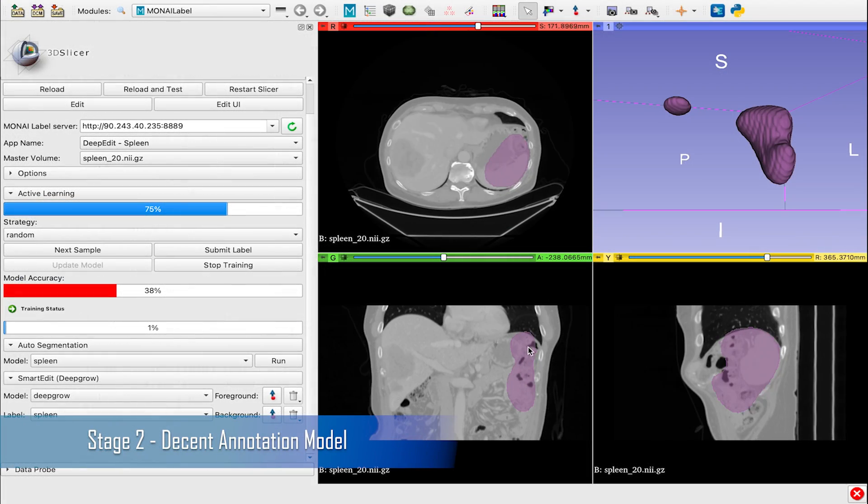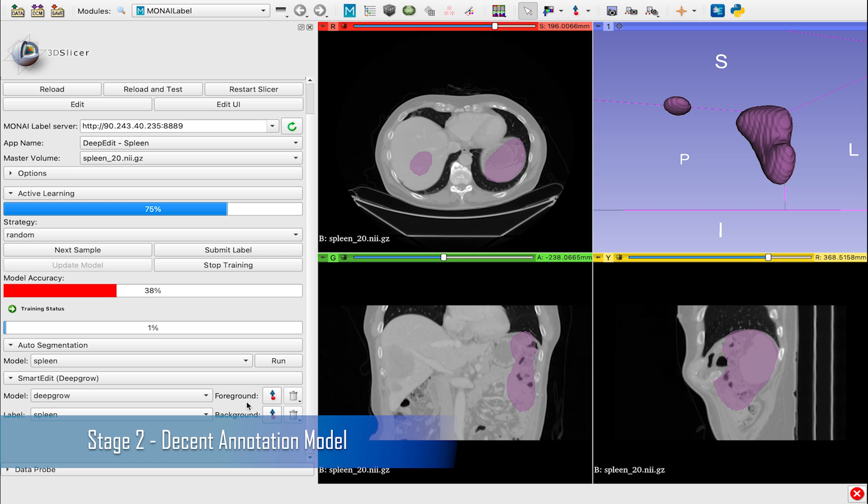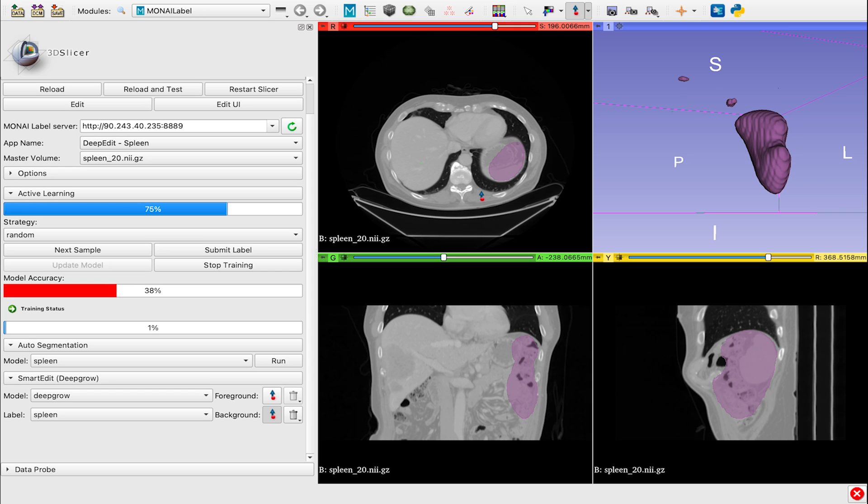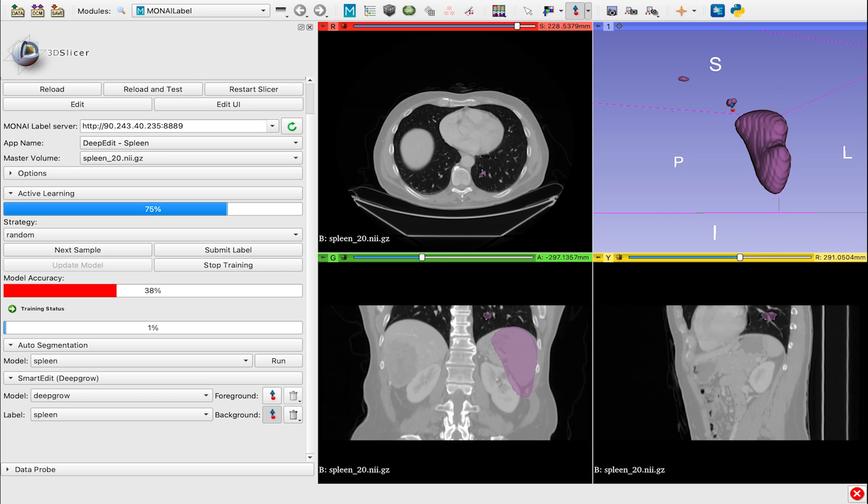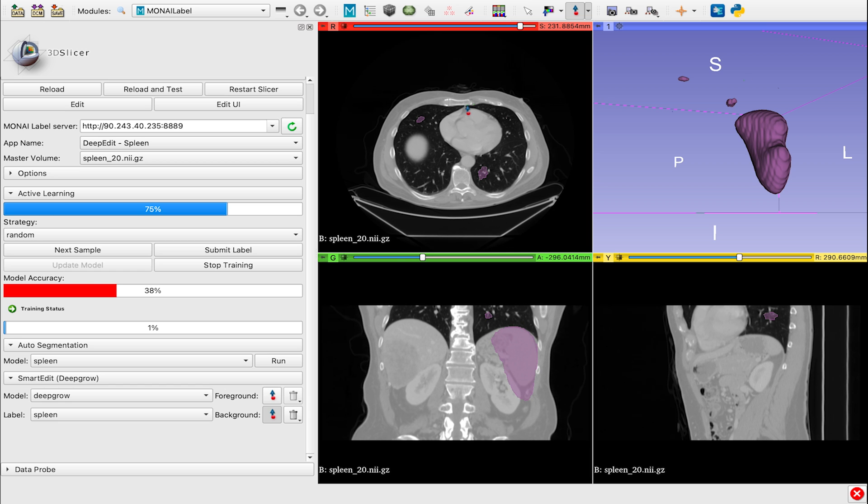Stage 2: We can utilize our AI model produced from Stage 1 to start annotating quicker. Since our model is still in its early phase, we'll have to do some additional cleanup since the model is producing inconsistent segmentations. We're now able to annotate in approximately 6 minutes per image.